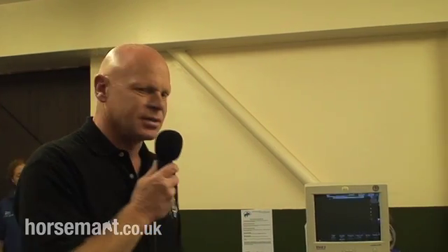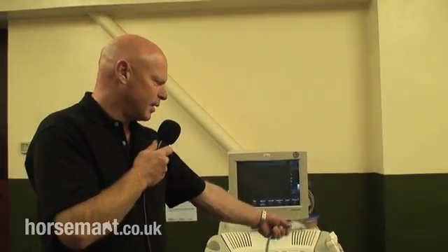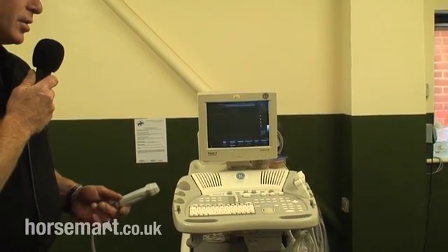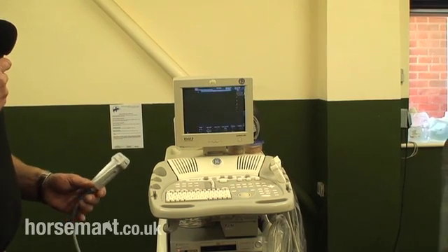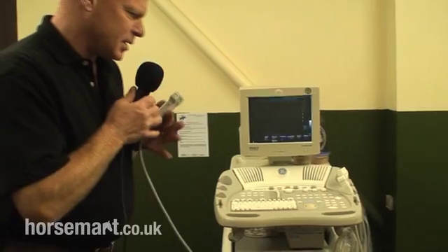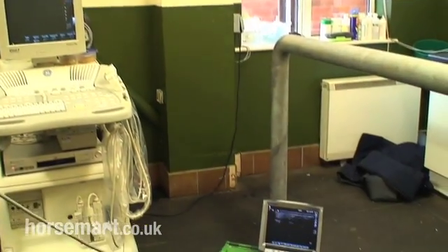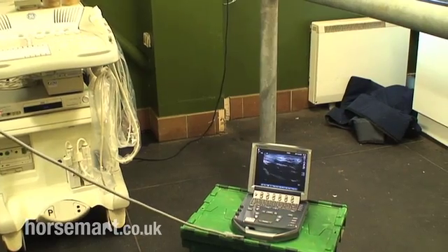Generally, the larger machine here at the clinic is used for multi-purposes because it does have a variety of probes, and the ones in the field will either have a probe for doing soft tissues of the limbs or a probe for doing rectal examinations in mares to look at the reproductive tract. Just to demonstrate — if we put that probe on my hand, although it doesn't make much sense — you can see the type of image we'll generate, and we'll go on to use this machine to scan a horse's leg.